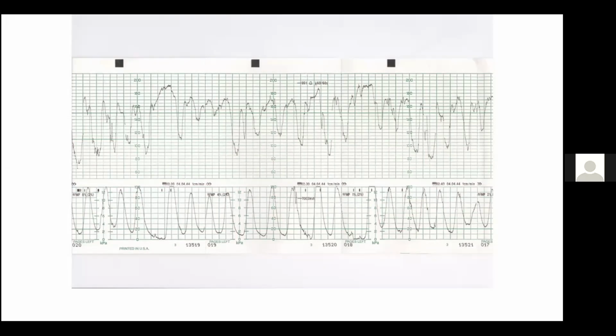So how are you going to deal with tachysystole? Firstly, you must identify the causes of the tachysystole. One important cause is patients that are being induced, that are receiving misoprostol. So when you see tachysystole, you should ask yourself, has this patient been receiving misoprostol? Number 2, patients receiving oxytocin.